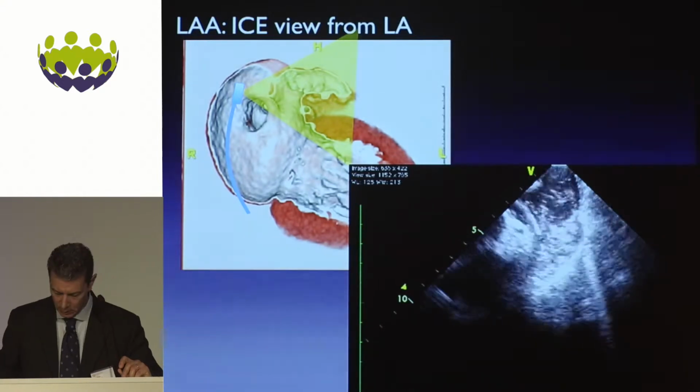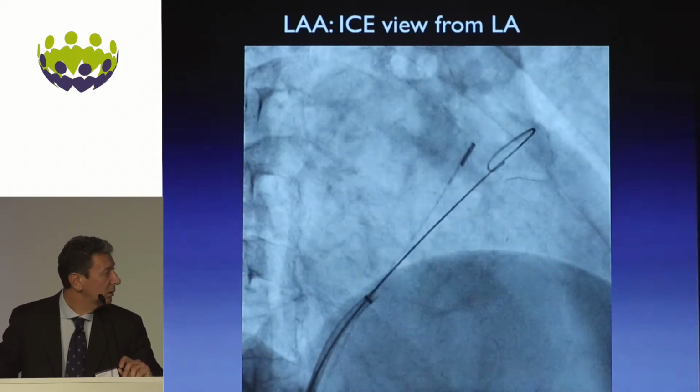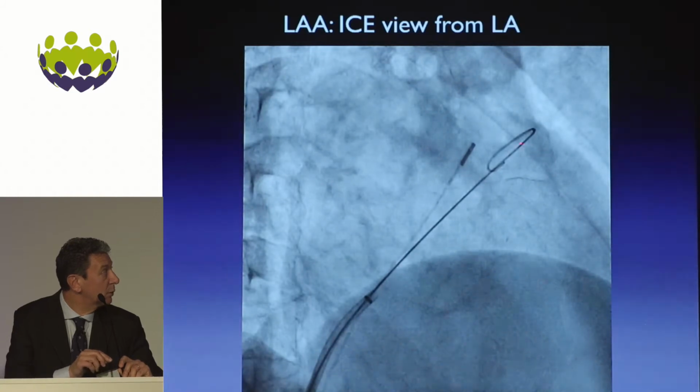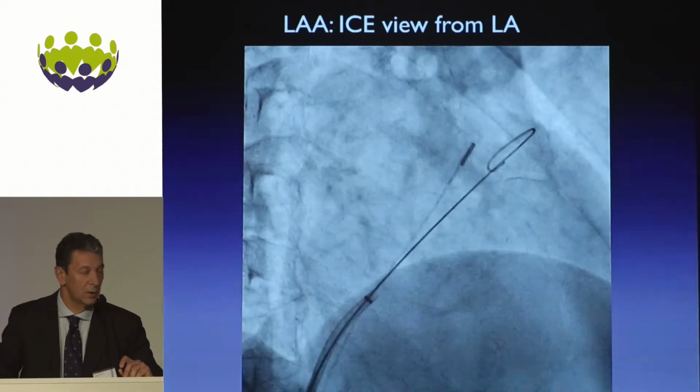The problem is how to get the probe into the left atrium. We have two options. The first is to perform a second transseptal puncture, but this is more traumatic for the patient. The second is to keep the wire that you used after the transseptal puncture in the left superior pulmonary vein, and manipulate and advance the probe through the same hole used for the transseptal puncture.